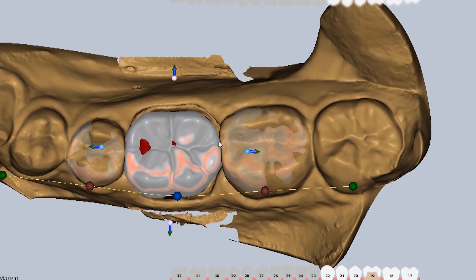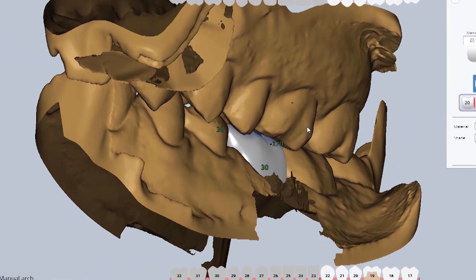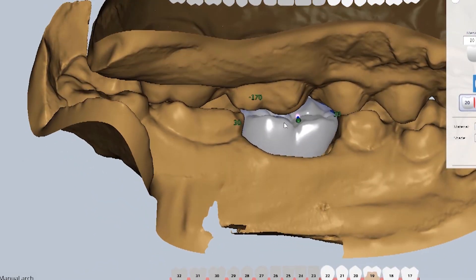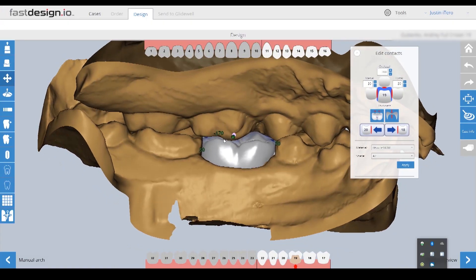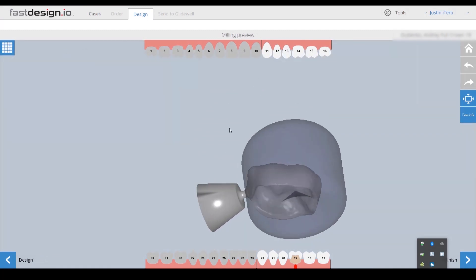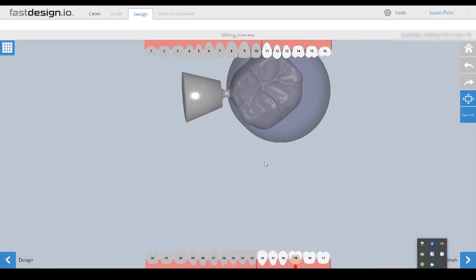From there, the software analyzes the adjacent and opposing dentition to establish the appropriate proximal and occlusal contacts for this restoration, which can then be adjusted to the user's desired strength values. I spend no more than three minutes marking the margin and designing the restoration.